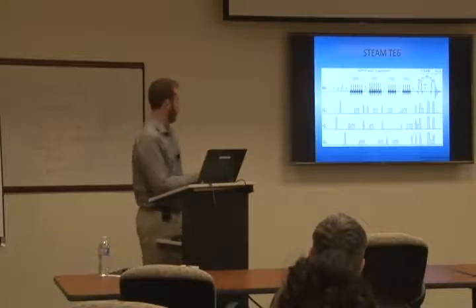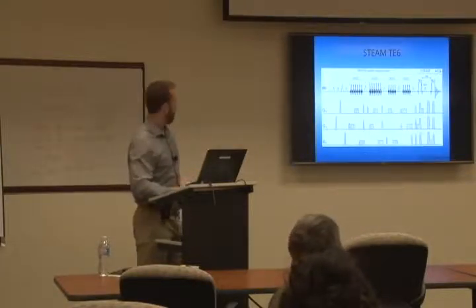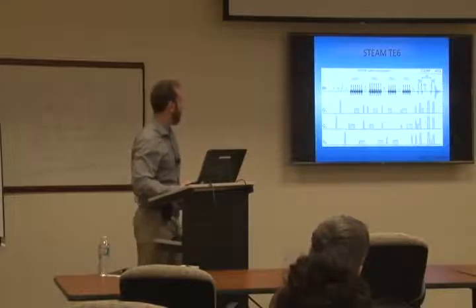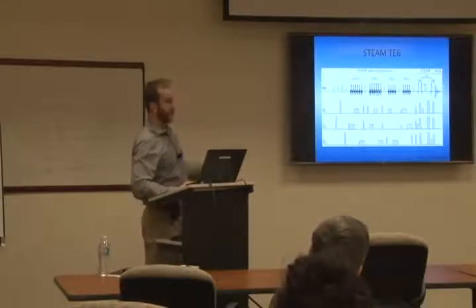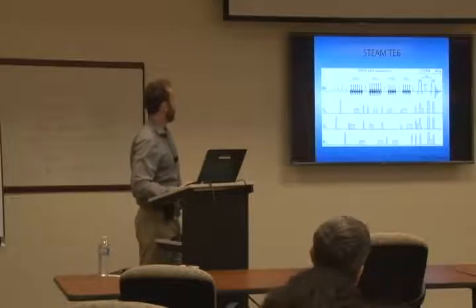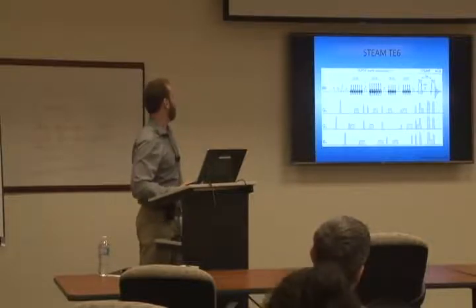whatever we want with. And this, I'm just showing this because I wanted to show you all the different things that you can get. So the basic STEAM sequence has normal RF pulses here. Okay? This one that comes in that spectroscopy package has fancy RF pulses. So it allows you to get echo time way shorter just from that tiny modification.